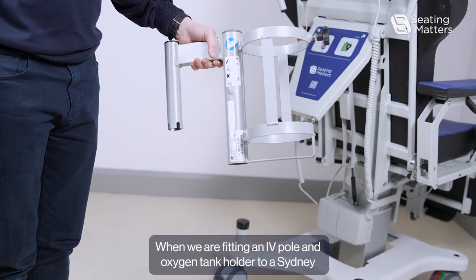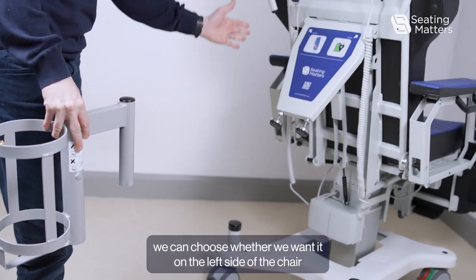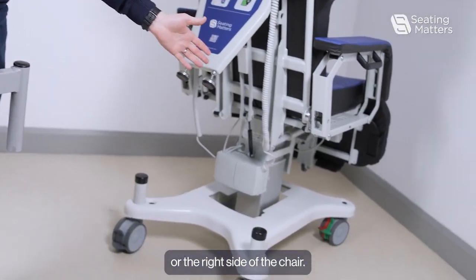When we are fitting an IV and oxygen tank holder to a Sydney, we can choose whether we want it on the left side of the chair or on the right side of the chair.